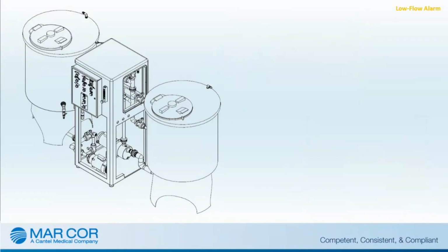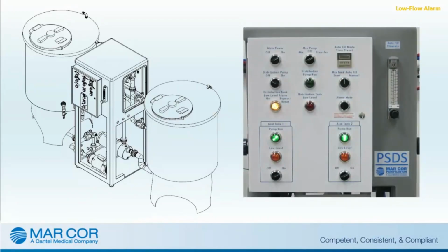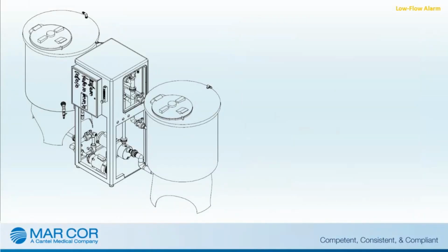The low flow condition is typically observed when the solution level in the mix tank empties while being transferred to the distribution tank. This is a normal occurrence and can be expected upon the initial daily transfer. An audible alarm sounds to prompt the user to reposition the mix pump hand switch and plumbing valves once transfer is stopped. When the mix pump hand switch on the PSDS is turned to the off position, the alarm will be discontinued. The alarm mute push button switch can be pressed to silence the audible alarm prior to switch and valve repositioning.